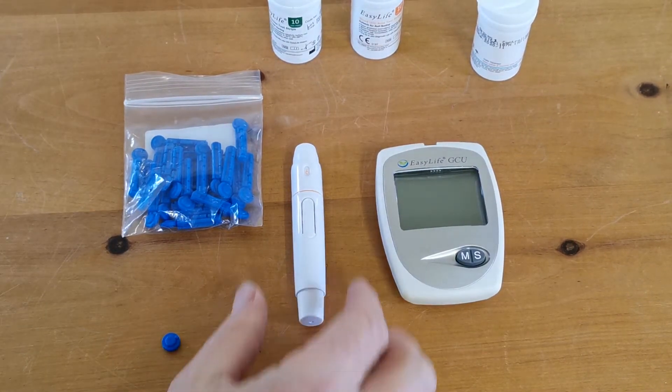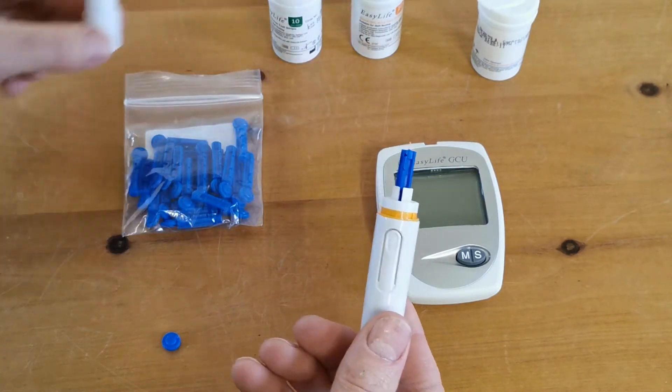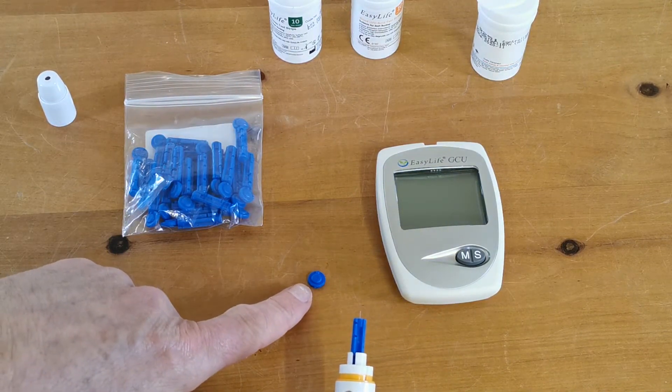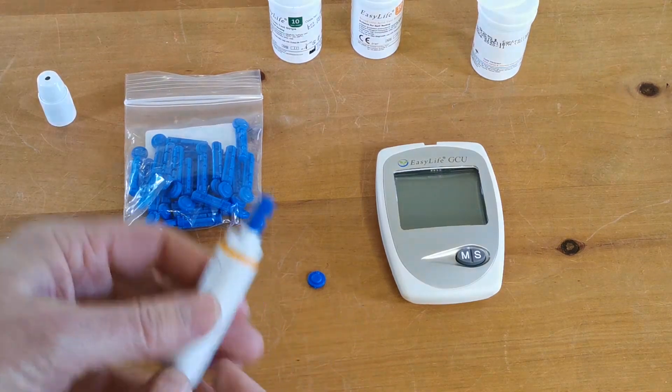So first things first, your used lancet. To dispose of that, unscrew the lancet device. You'll see the lancet is in there. Now you should have retained your little round bobble of plastic that came off the sterile lancet when you first used it.